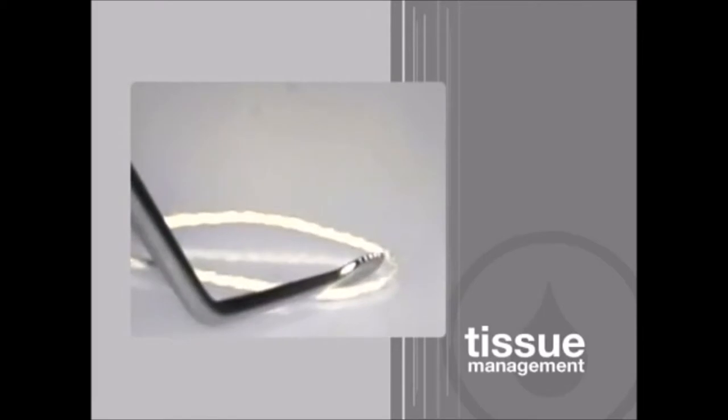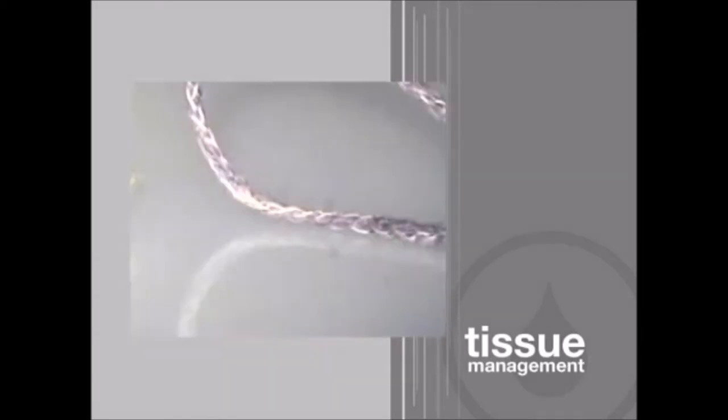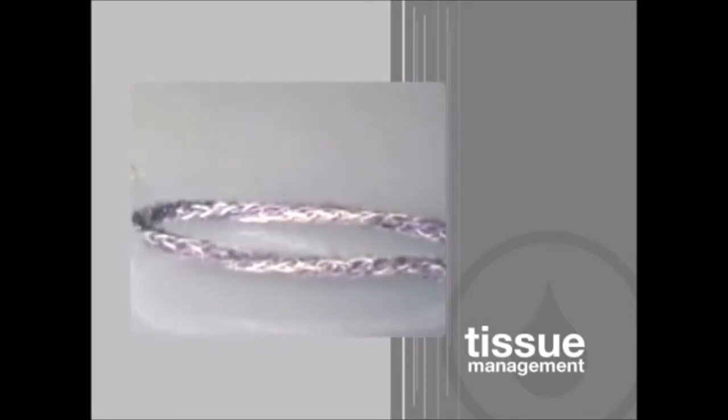Watch what happens when an ordinary braided cord is pushed down — it springs back up and returns to its original shape. But when the Ultrapack cord is pressed down, it stays.